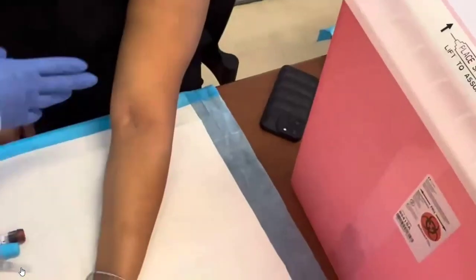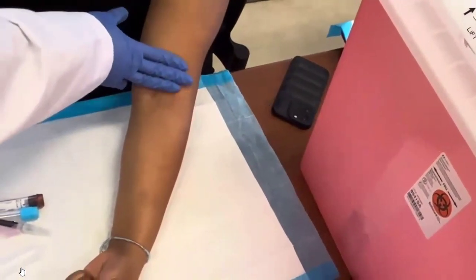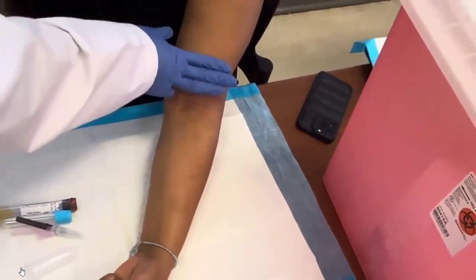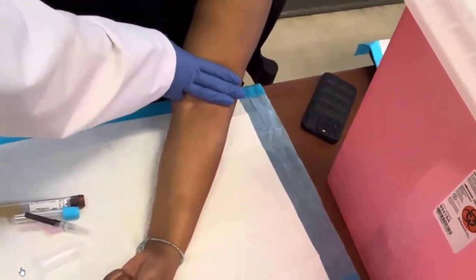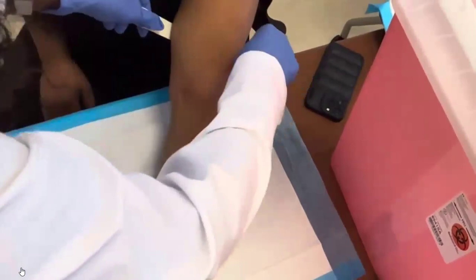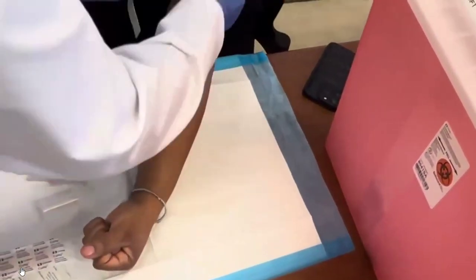And as you guys know, you want to tie the tourniquet 3 to 4 inches above the elbow, depending on how big your hand is or how big your fingers are. That's maybe about 2 to 3 fingers. So we're going to tie that there. I do have a video on how to tie the tourniquet, so here I'm not going to get into that. I'm just going to go ahead and tie it on there.